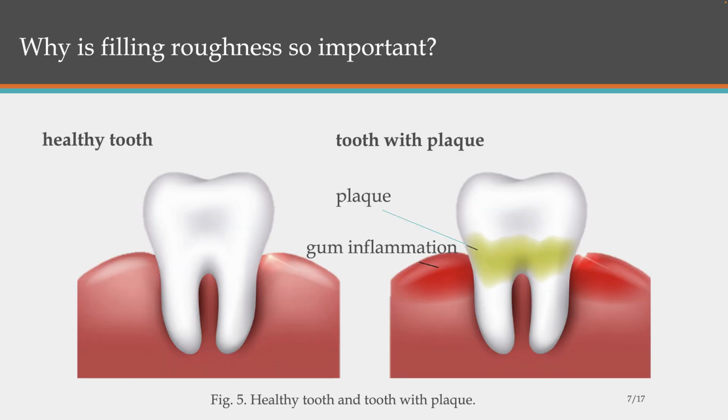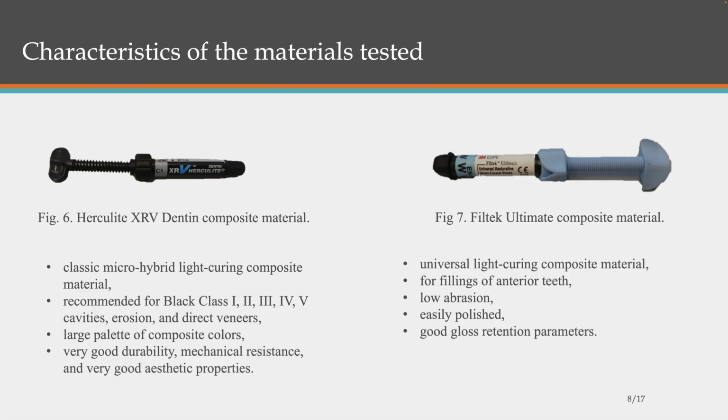The treated tooth is filled with composite material. When finishing the filling, it is very important to polish it properly, as a rough surface encourages the accumulation of plaque, which leads to the formation of secondary caries. Since the roughness of the cavity filling significantly affects the accumulation of bacterial plaque, different types of common tools in the dental office for cavity preparation were tested.